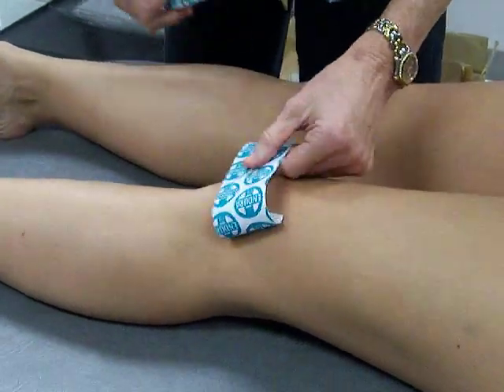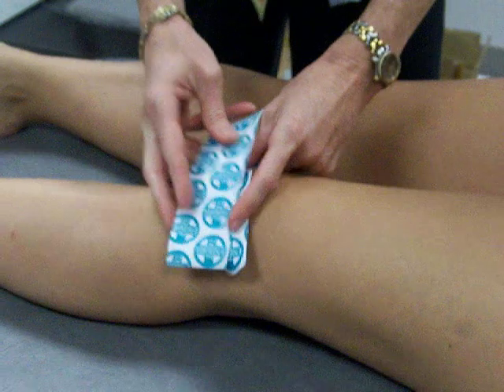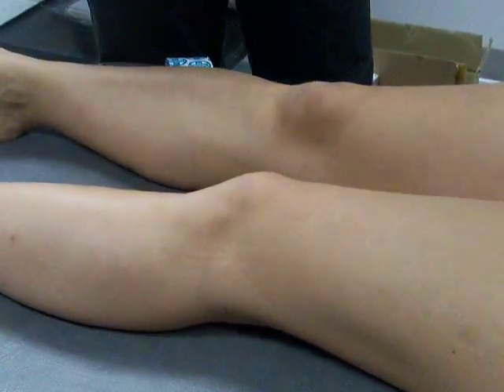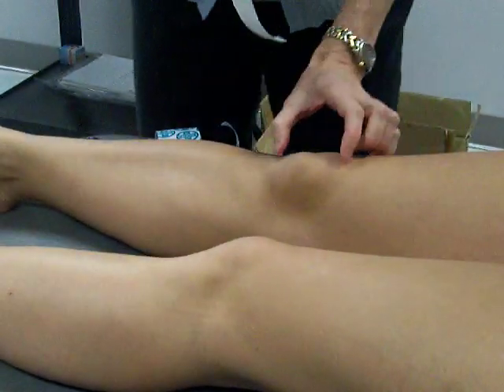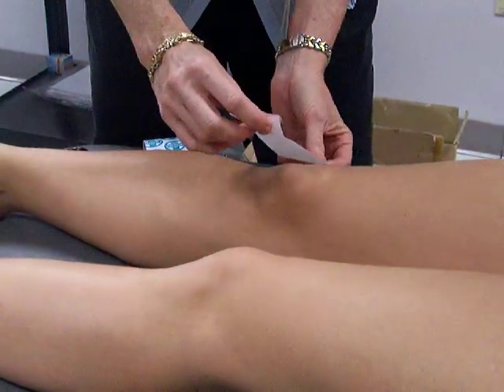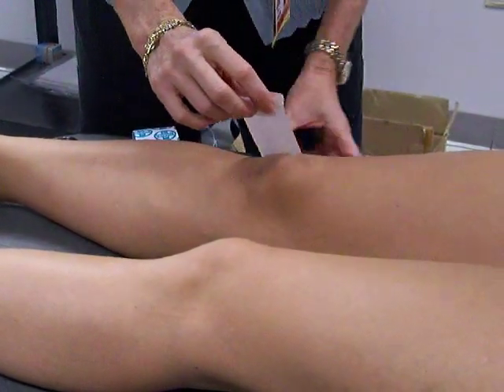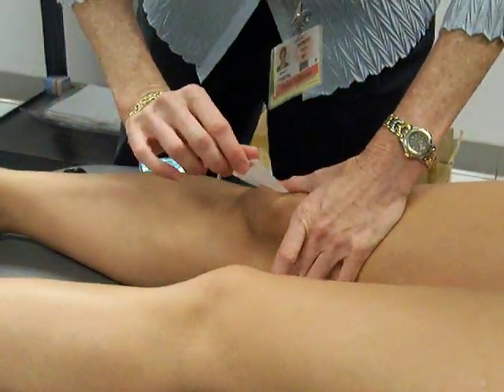You're going to put two pieces of tape covering the patella — not high or low and not right on top of each other. Pull your tape off, and assess the inferior and superior poles. I'm going to start with the lower half, starting way on the side. I'm going to push the kneecap over, pull the tape, and lift.